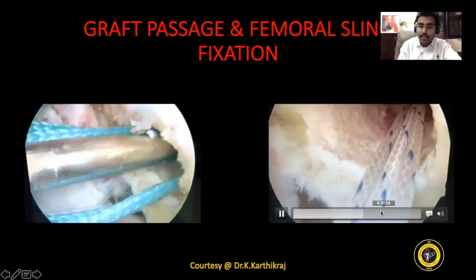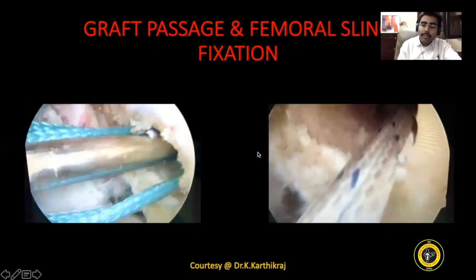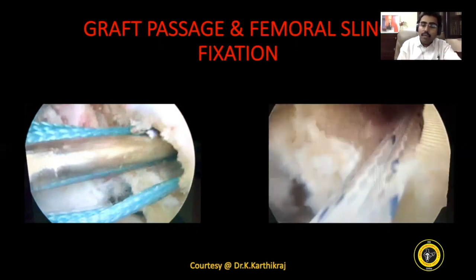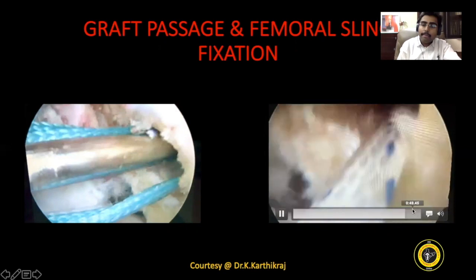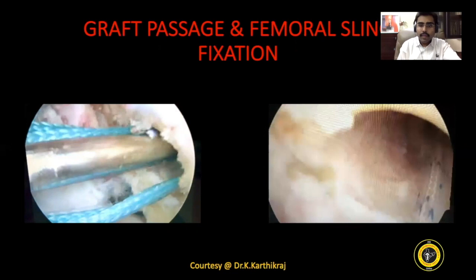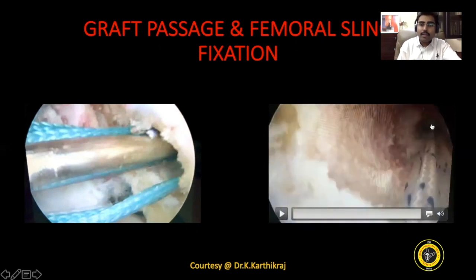This is the image I always love to look at through the tunnel, where I can see the Ultrabutton placed flush with the femoral cortex. I think you will see in a minute. You see there, you can visualize the Ultrabutton sitting flush with the femoral cortex. We are doubly sure there's no soft tissue in between.